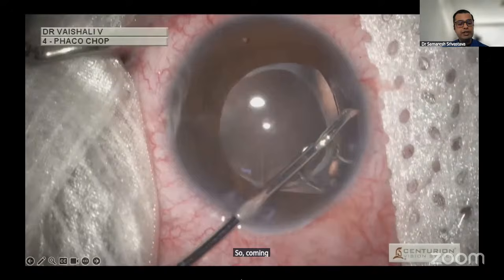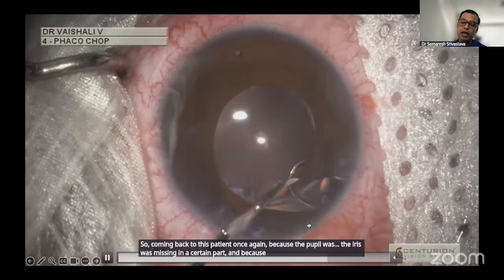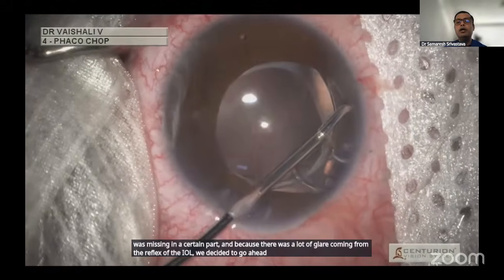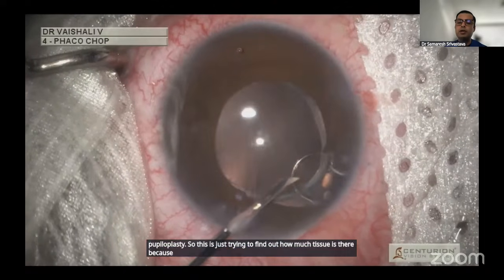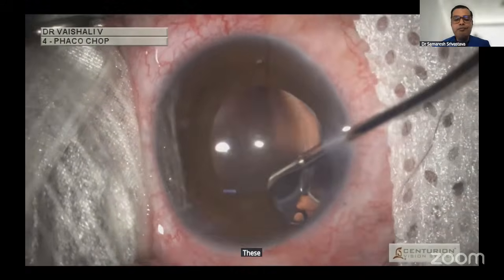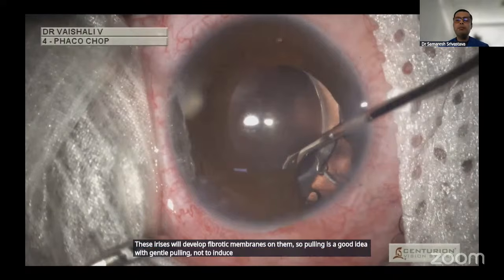So coming back to this patient once again, because the iris was missing in certain parts, and because there was a lot of glare coming from the reflex of the IOL, we decided to go ahead and do a pupilloplasty. So this is just trying to find out how much tissue is there, because there has been obviously a traumatic iris tear causing retraction. These irises will develop fibrotic membranes on them. So pulling is a good idea, with gentle pulling, not to induce an iridodialysis, but enough to make sure that the rollout of the iris happens well.